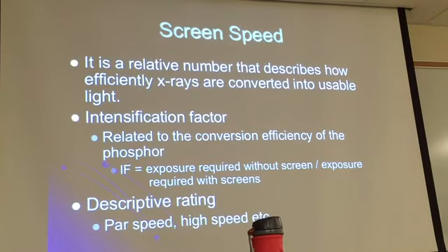Say you use 40 mAs and 50 kVp. This is what we have, and a beautiful film. We like it. So what we do now is we bring our ion chamber. Ion chambers are used to measure exposure. So now you're not going to measure the beauty of the film. You're going to measure how many and the strength of the X-rays.